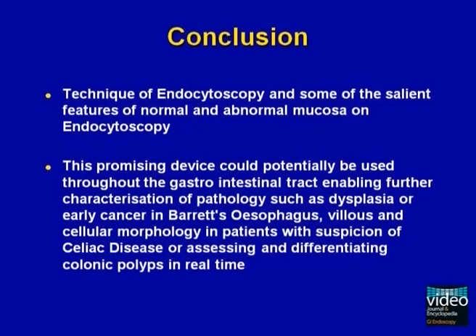In conclusion, we have demonstrated the technique of endocytoscopy and some of the salient features of normal and abnormal mucosa. This promising device could potentially be used throughout the gastrointestinal tract, enabling further characterization of pathology such as dysplasia or early cancer in Barrett's oesophagus, villous and cellular morphology in patients with suspicion of celiac disease, or assessing and differentiating colonic polyps in real time.